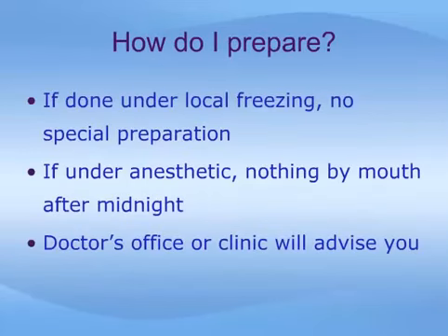Typically, there is no special preparation required if you are having a simple cystoscopy under local anesthesia, although your doctor's office or clinic may advise you of specific requests. It is probably best to eat a light breakfast or lunch prior to the procedure. If the procedure is to be done under general anesthesia, you'll be asked not to take anything by mouth, usually after midnight the night before.